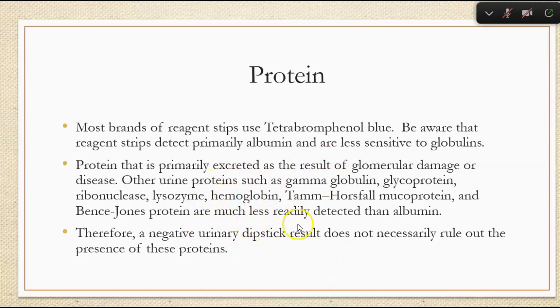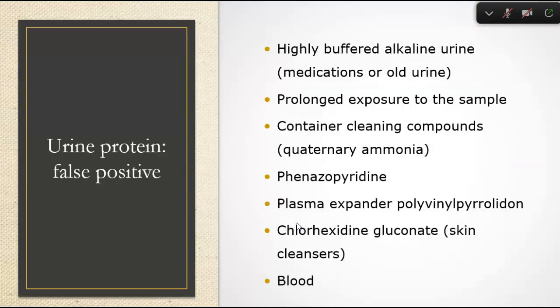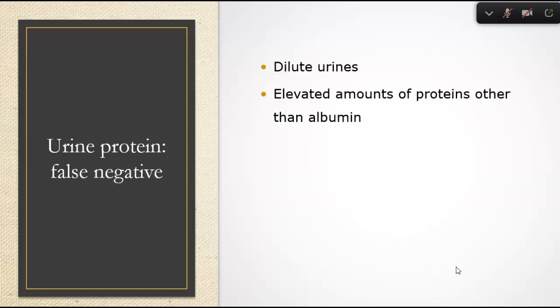A negative urinary dipstick doesn't necessarily rule out the presence of all other proteins — we have other tests that help detect those. False positives can occur in highly buffered alkaline urine, with prolonged exposure to the sample, containers cleaned with compounds like ammonia, other drugs, plasma expanders, blood, or skin cleansers like chlorhexidine gluconate. False negatives occur with extremely dilute urine or protein present that's not albumin.